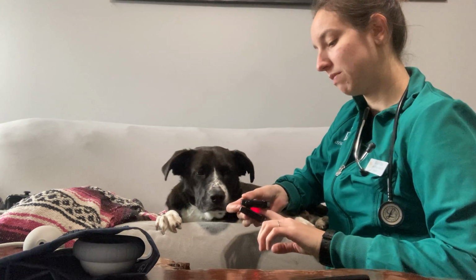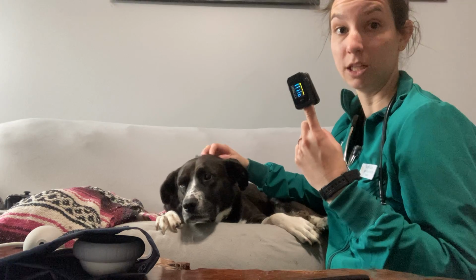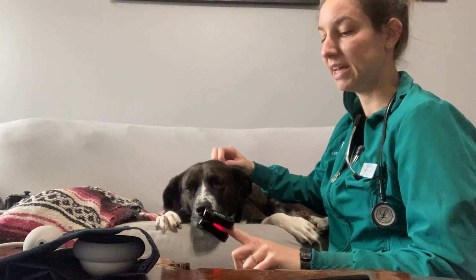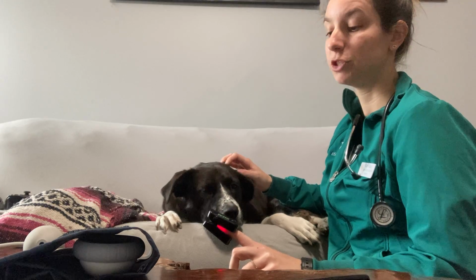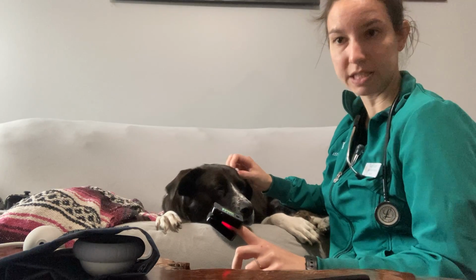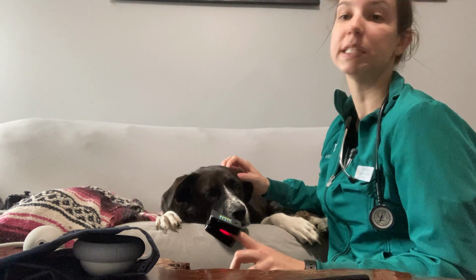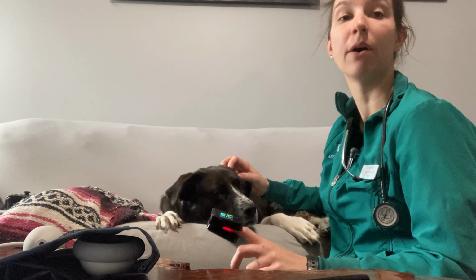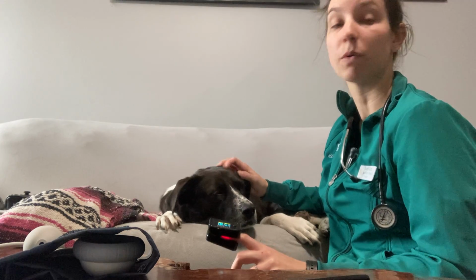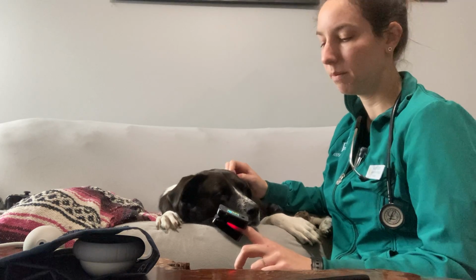For an adult human, if I were to put this on my finger and take my own pulse ox in lieu of Sadie's, then it will spit out a reading here in just a moment. My reference range for pulse ox for oxygen saturation is going to be between 95 and 100%. Obviously, at any point with the vitals I have mentioned so far and in the future, if anything is out of the reference range, it is worth verifying, noting, and potentially notifying the provider.